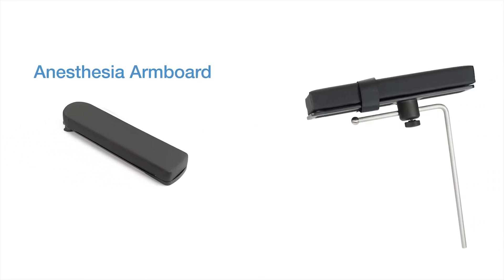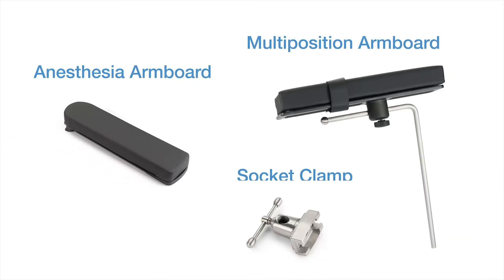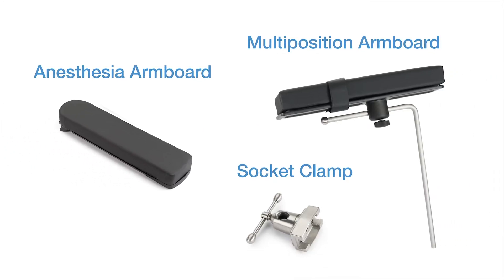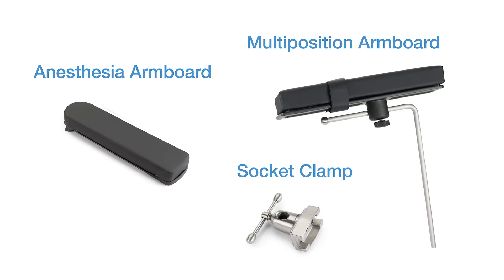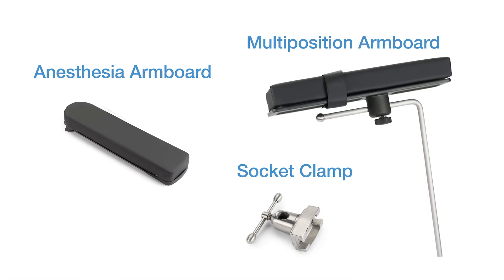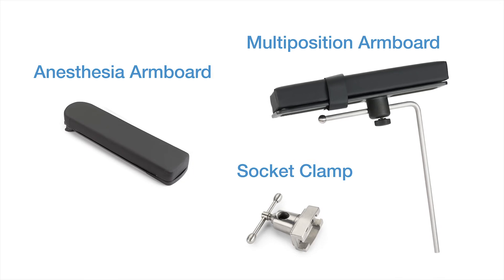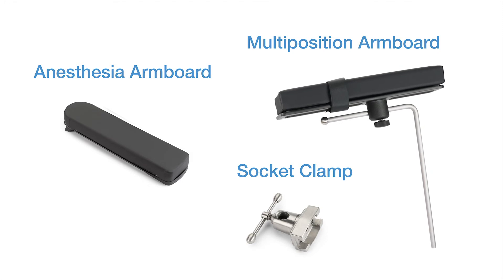The OT-1000 series table is equipped with both an anesthesia armboard to help position the arm on the non-operative side of the body, and a multi-position armboard to help position the arm on the operative side of the body, to ensure patient arms are properly positioned during the procedure.